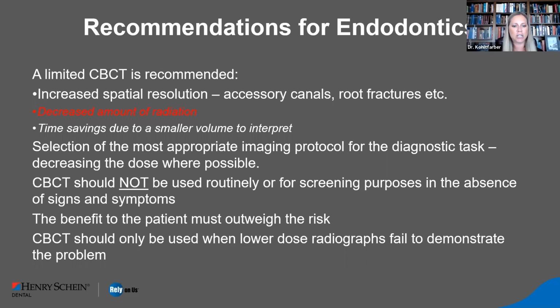They say CBCT should not be routinely used for screening purposes in the absence of signs and symptoms. Now, if your patient comes in and has signs and symptoms, it is okay to go ahead and take a CBCT, especially if the 2D imaging doesn't show you what you want to see. Again, the benefit to the patient must outweigh the risk. So kind of the similar terminology, we're going to hear it all the way through. CBCT should only be used when lower dose radiographs fail to demonstrate the problem. So they say, go ahead and take a 2D first. If you can't see it, move on to the 3D.